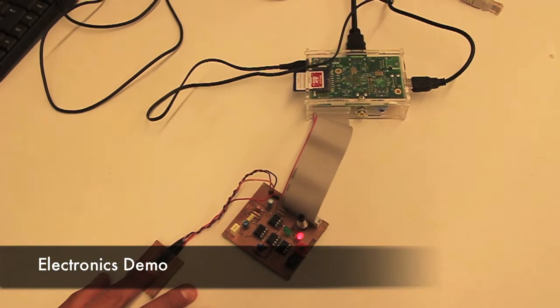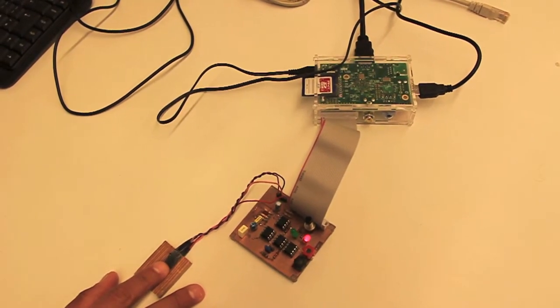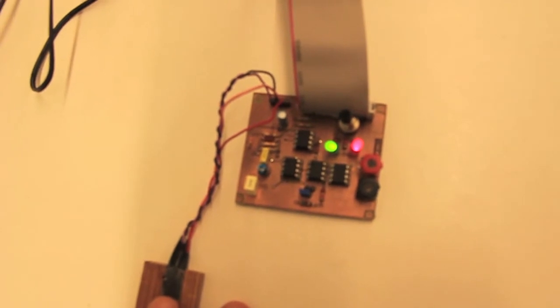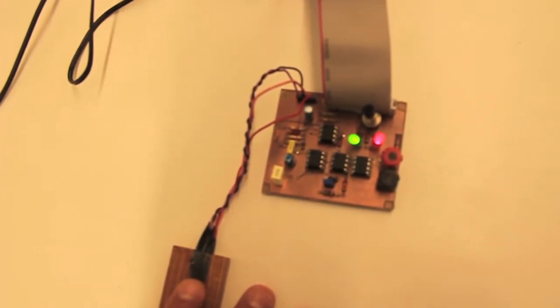The electronic system is composed by 3 different parts. We have a Raspberry Pi, a PIC that processes the data, and a sensor. When the system is ready, the red light is shining. After pressing the button, the green light will shine to indicate that the system is acquiring. When finished, the light will stop shining for a moment. Then it will shine again while the system is processing the data. As you can see in the screen, all the results are shown.